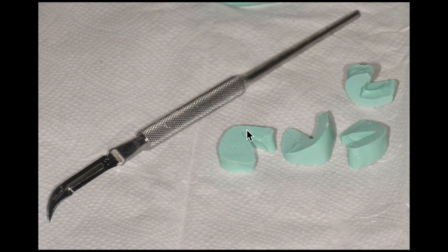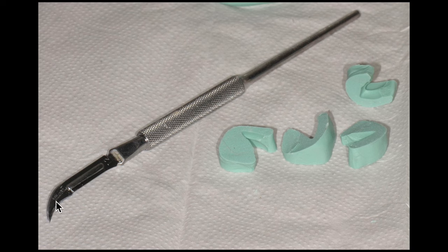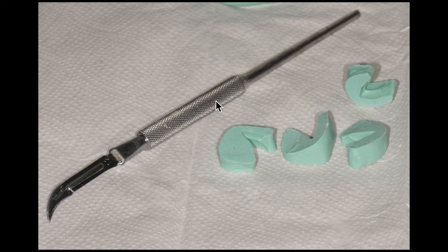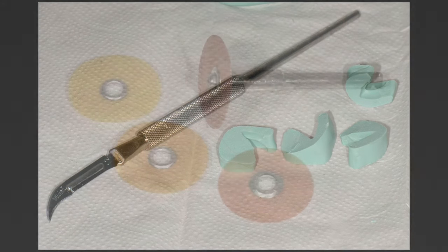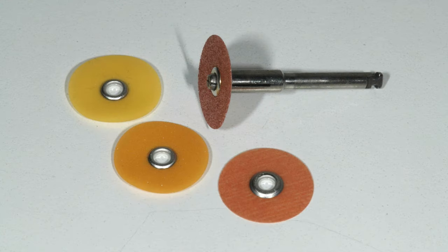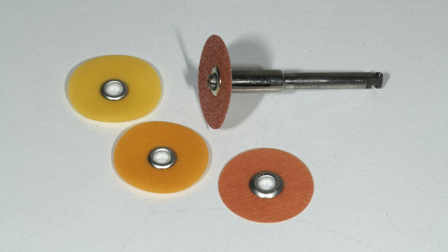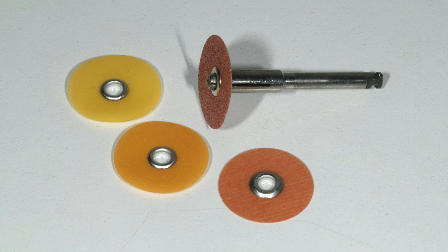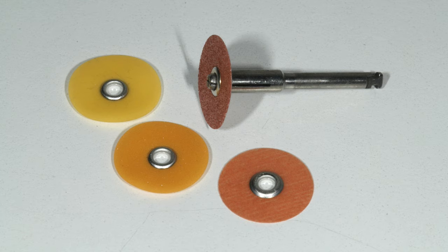The putty I cut and section vertically with a 12B blade — that works out quite nicely. We use these soft flex XT discs. Any disc would work for this, but I like these because of the flexibility of them — they're mylar backed. I also like the enhanced cups.